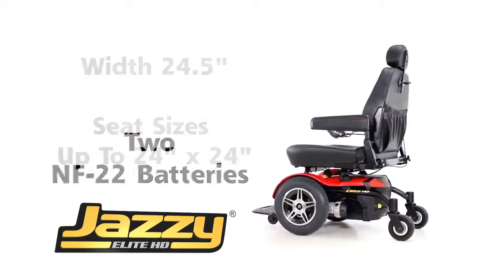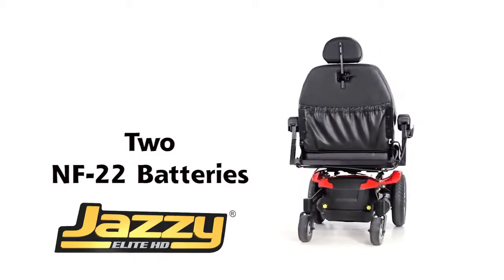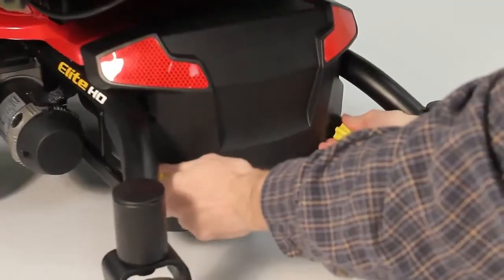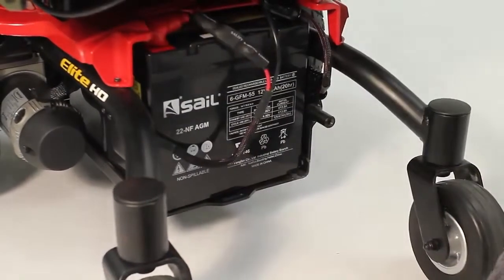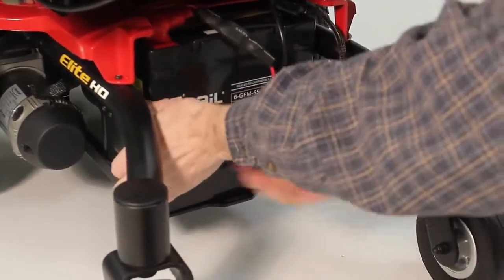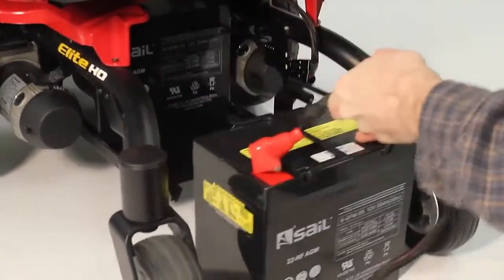The Elite HD comes with NF-22 batteries for robust drivetrain and optimal performance. Rear battery access allows for easy service without having to remove the seat or the shroud from the unit. Due to possible large seat sizes or rehab seating, rear battery access is essential.